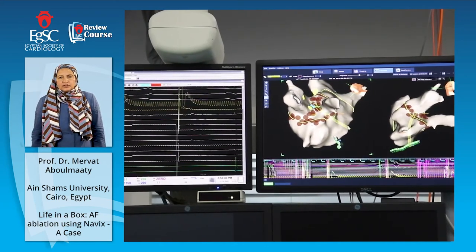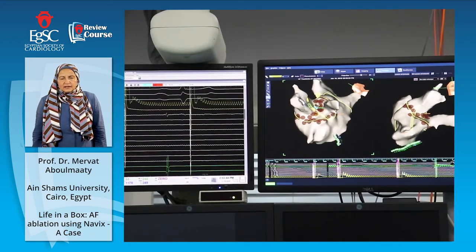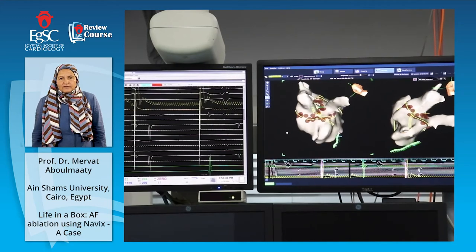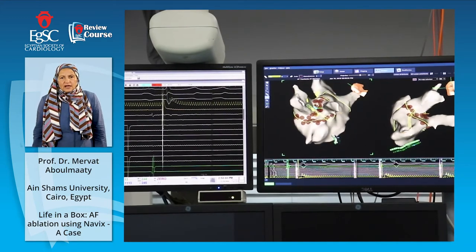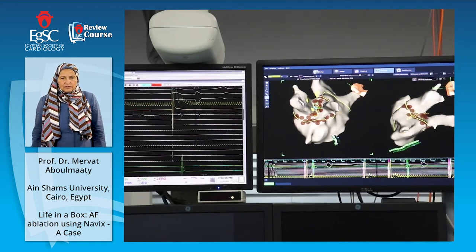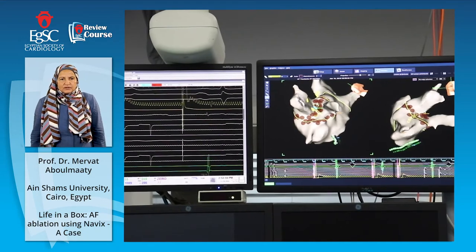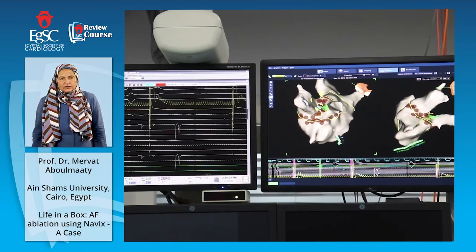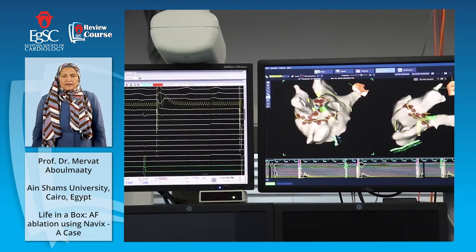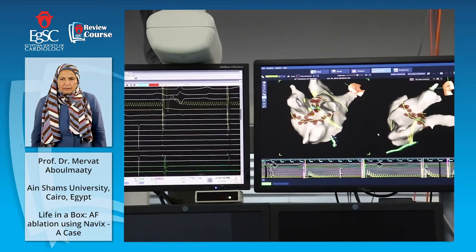this is the ablation of the WACA, left-sided WACA. The ablation catheter is ablating, and sometimes I do pacing from the ablation catheter, as you can see here, in order to make sure that every point is ablated. I go check the ablation line, I go check the veins, I go check for potentials. As you can see, I'm pacing from the ablation catheter, to make sure that there is no conduction from this side. So at this point, I say, okay, fine, the left-sided WACA is done, perfect.